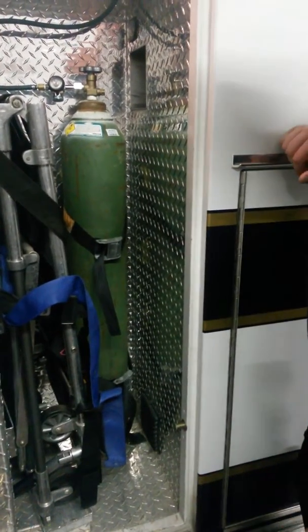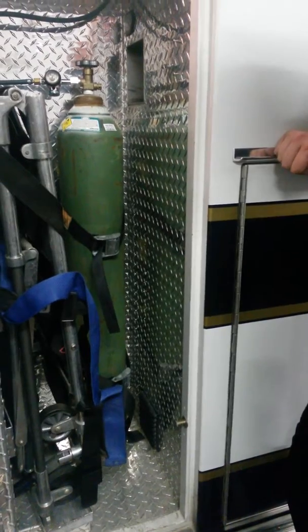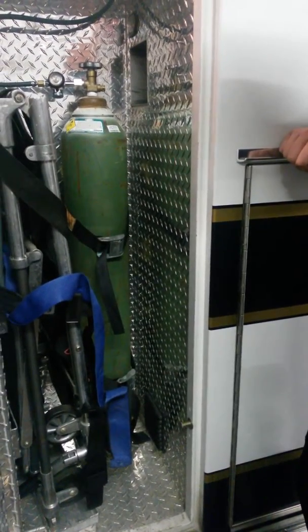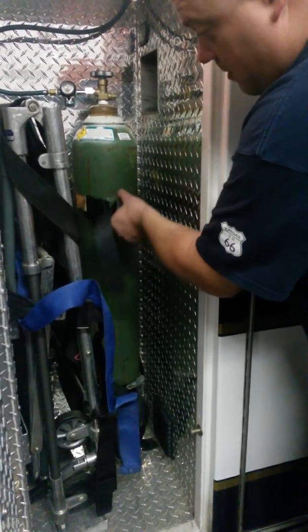Just another quick video reminder of how to secure an oxygen bottle in an ambulance. Doesn't sound like something that we should have to train on, but apparently we still do.